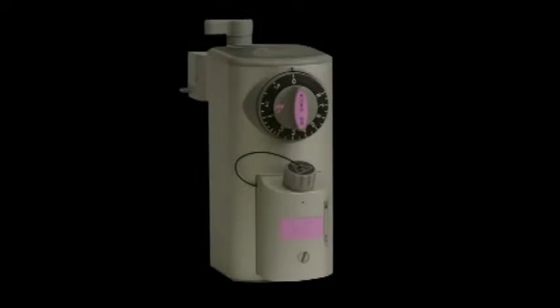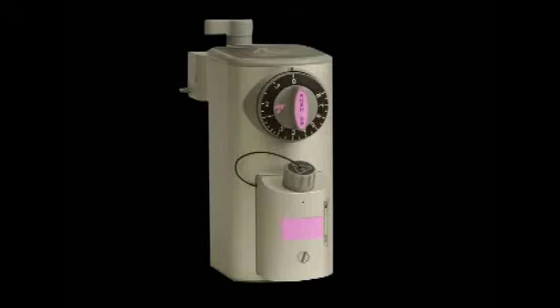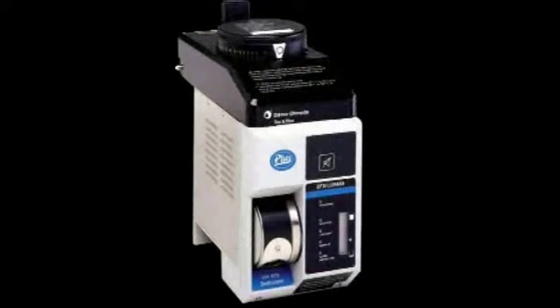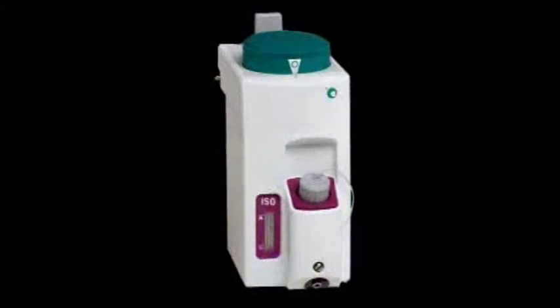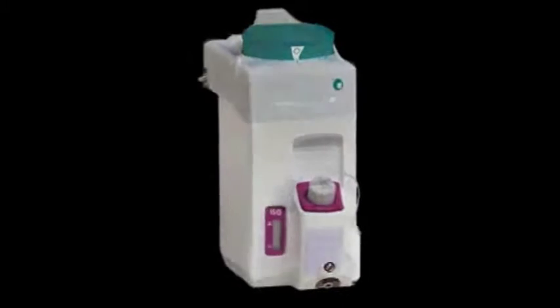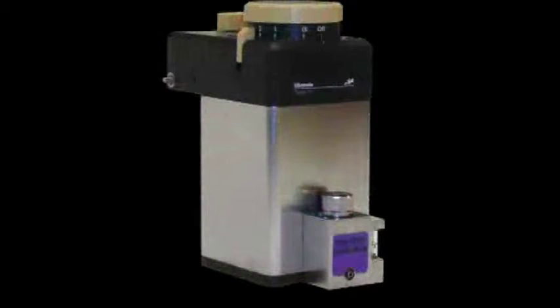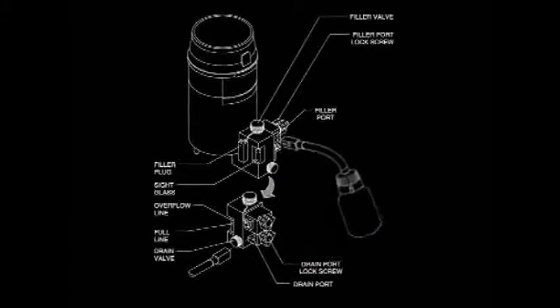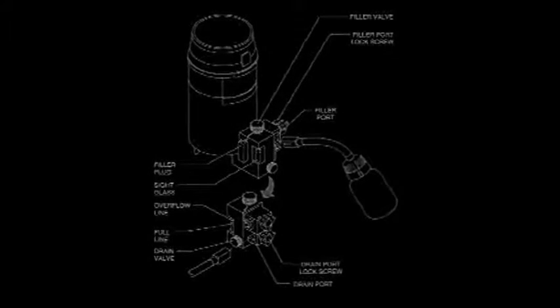Vaporizers. As already indicated, the key component of the anesthesia machine is the vaporizer. There are as many different models as there are different anesthesia machines. Each vaporizer is agent-specific and calibrated for a single gas. Regarding filling a vaporizer, there are two types, namely funnel or keyed filler types. The latter one decreases the likelihood of filling the vaporizer with the wrong agent.